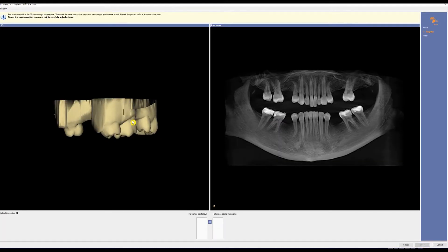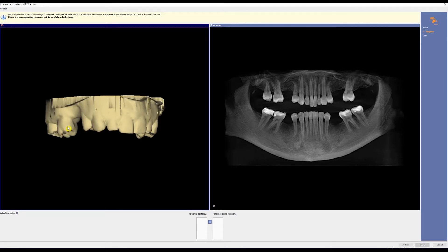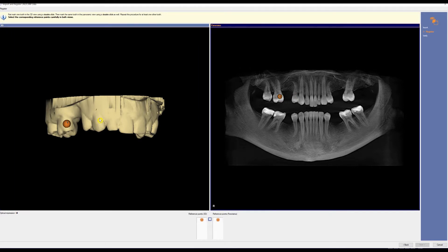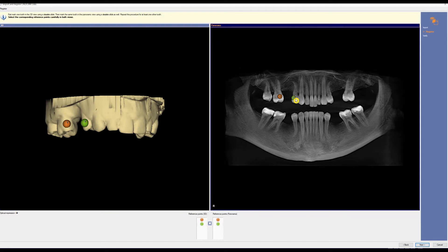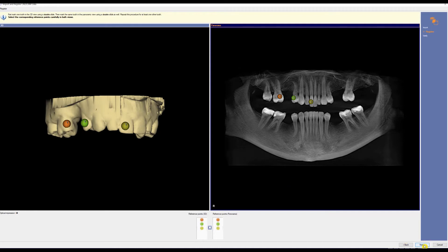Now we'll need to register and select three reference points. We'll double-click on the SSI, and then at the same point on the pan. We'll do this three times. The key is to pick teeth that do not have metal. Once we have three, let's click Next.